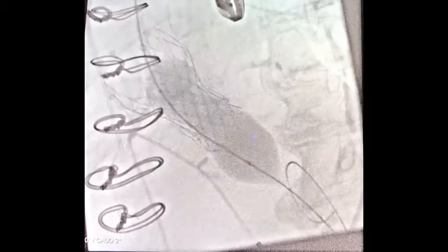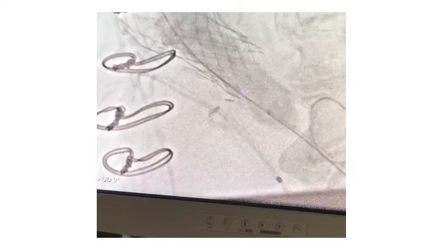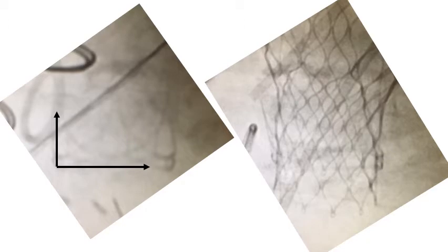In this case, we applied this knowledge and post-dilated the Trifecta valve with a 22-millimeter True balloon to 10 atmospheres. Notice how the balloon dog-bones and by doing so pushes the surgical valve struts outward. Although the inflow of the valve remains constrained within the unbroken frame of the surgical valve, the supraannular transcatheter valve has slightly more room to better expand. Here is the Trifecta before any intervention with the struts at 90 degrees to the sewing ring, and after valve-in-valve TAVR and post-dilation the struts are pushed out to about 120 degrees.